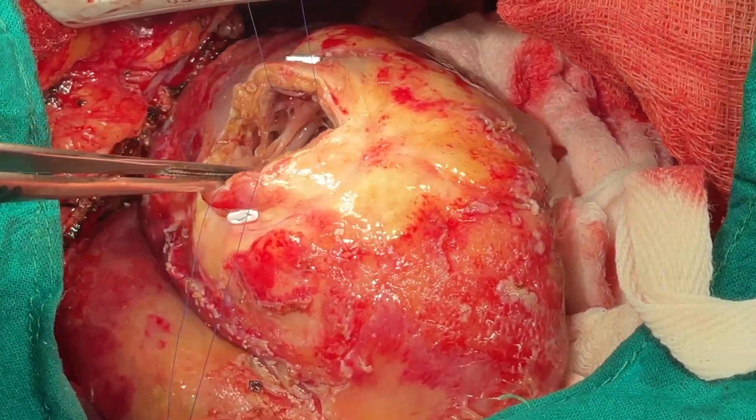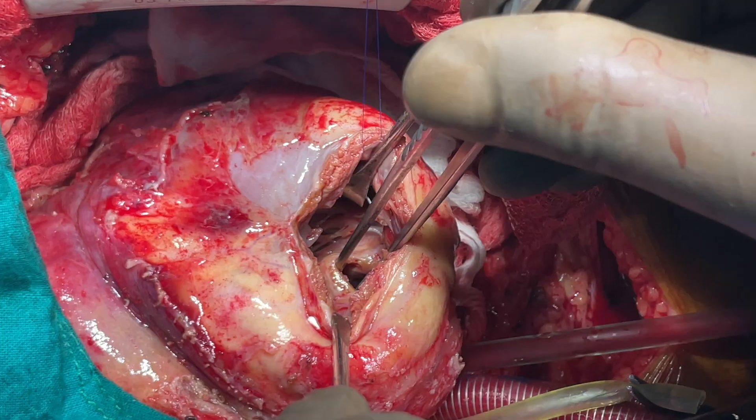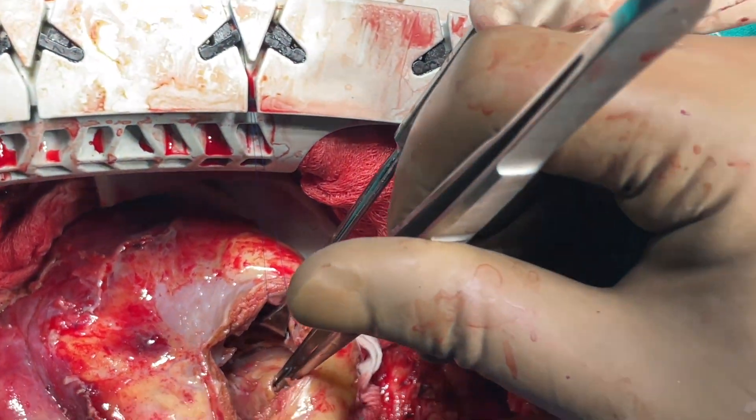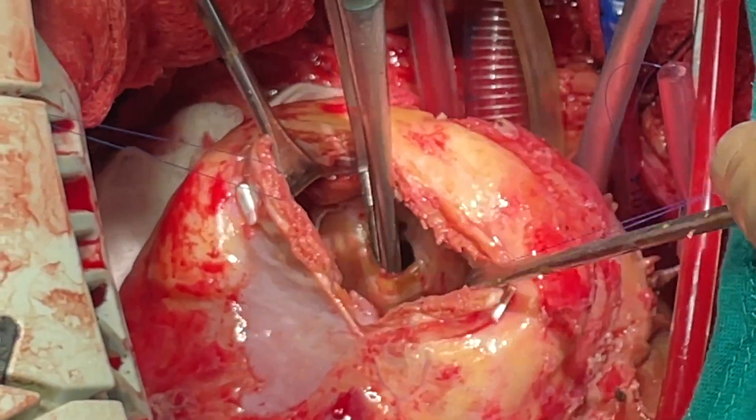The myocardium was inspected for the extent of infarction and the VSD was subsequently identified. Note that the myocardium surrounding the defect is infarcted and the edges of the defect are very friable.